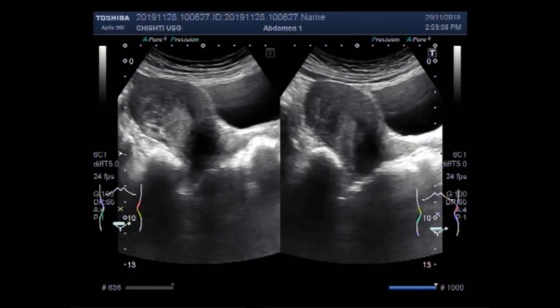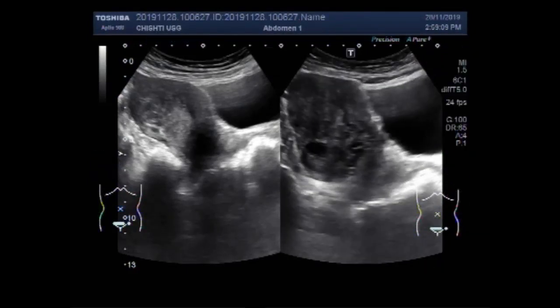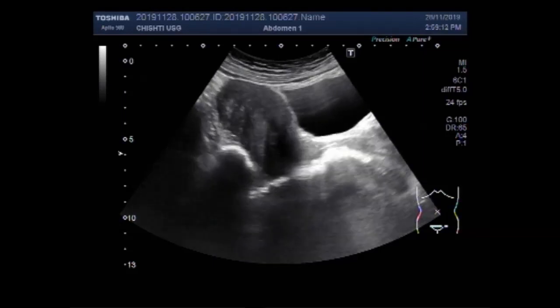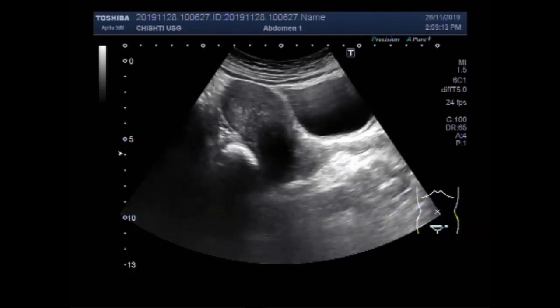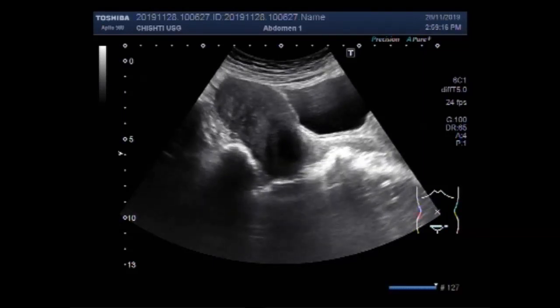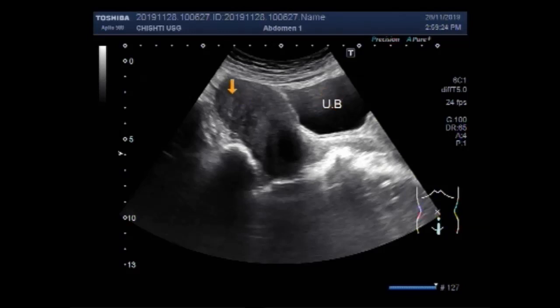Dear viewers, I hope you are all fine. This ultrasound video shows multiple findings in a female patient — scanning of the genital organs. You can see this is the uterus, and this is the cervix.